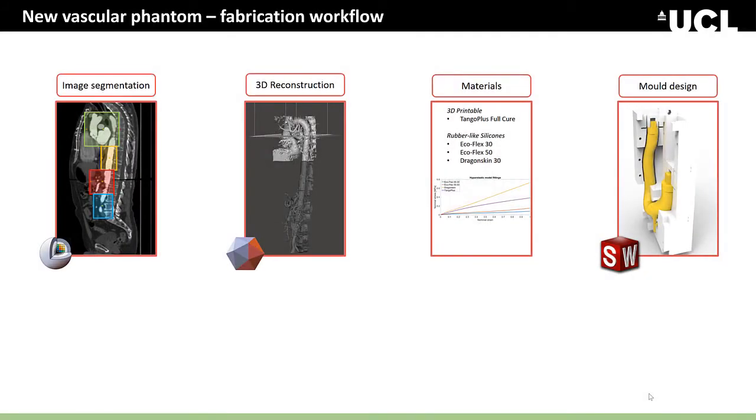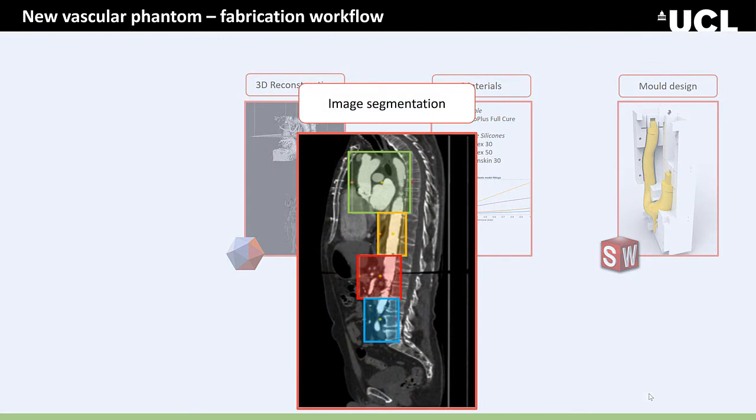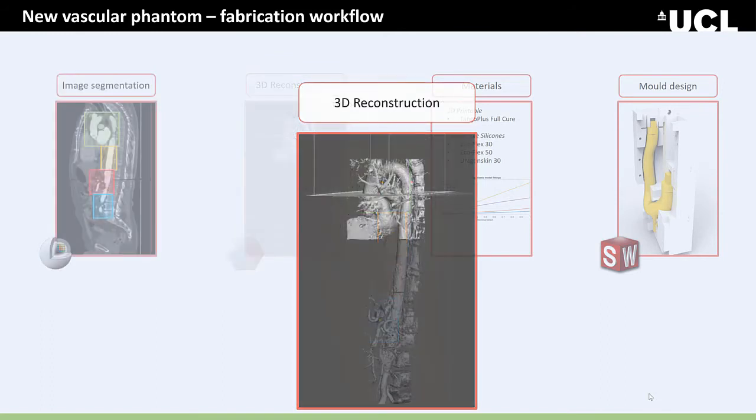The manufacturing process involves many phases. The first phase was the image segmentation, starting from patient-specific data. The volume has been divided into 4 modules. For this specific prototype, we focused our attention on the aortic arch region. The image has been segmented using 3D Slicer, an open source software for DICOM file editing and visualization. The model has been refined using Meshmixer, a CAD open source software.